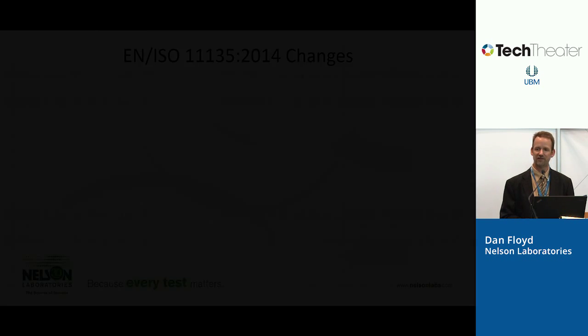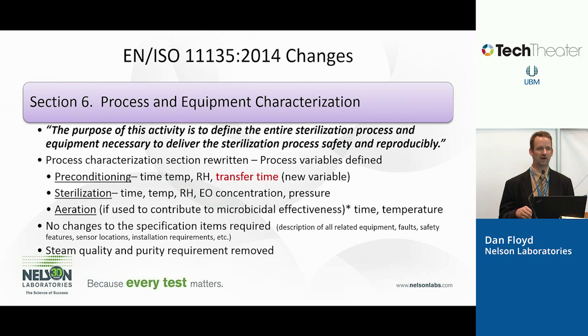A lot more information on health and safety. Occupational exposure to ethylene oxide is becoming a bigger deal. So there's a lot more safety put into this document that wasn't in there before.